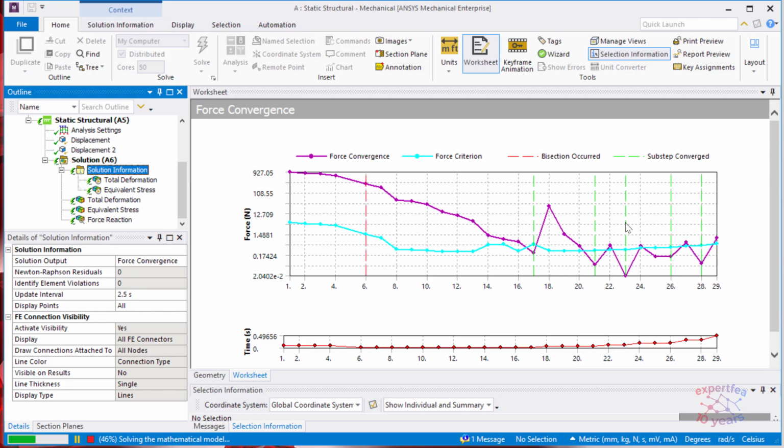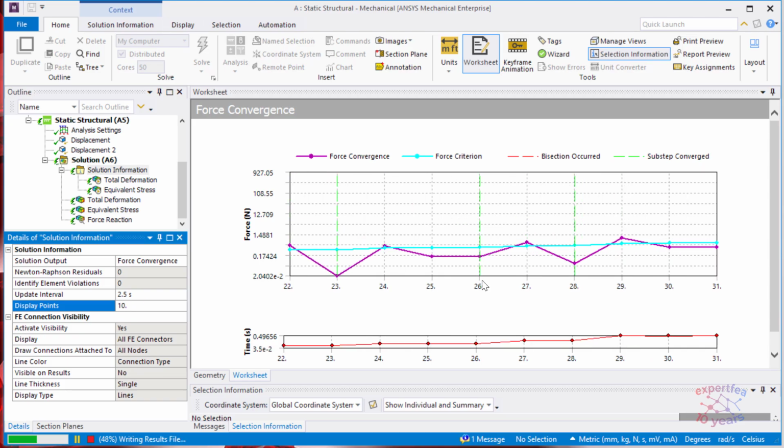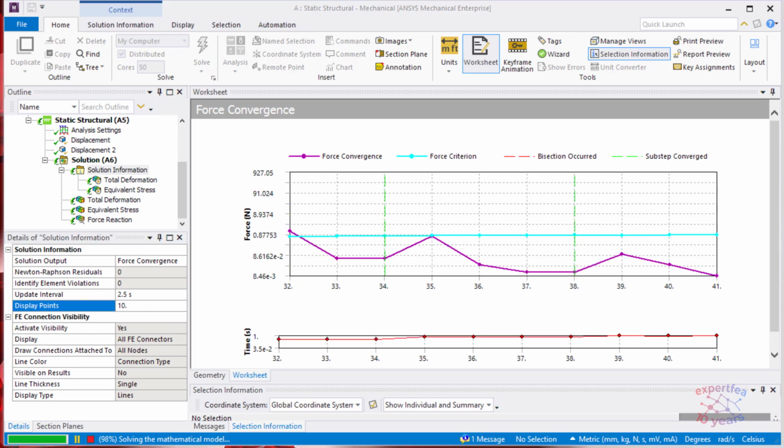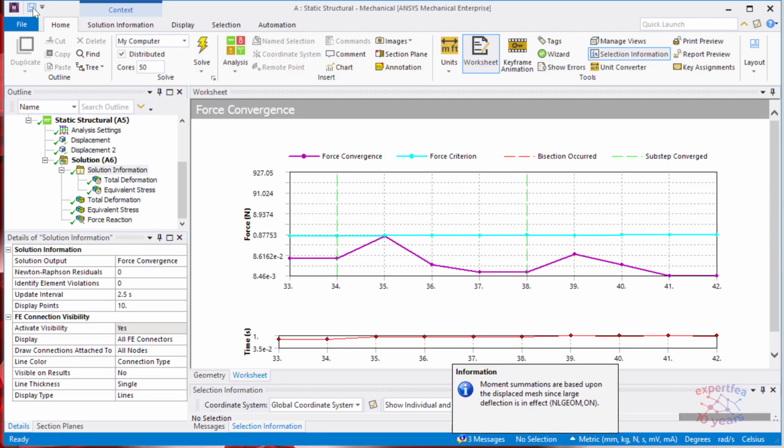If the graph gets too cluttered, you can make it coarse or rarefy it by choosing here, instead of showing all display points, maybe show the last 10 points, and we have a much more decent view over the force convergence plots. I will pause and then go back to the final steps. So we're approaching the end of the solving. Remember to save often.